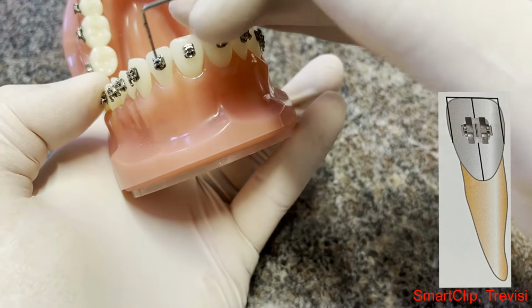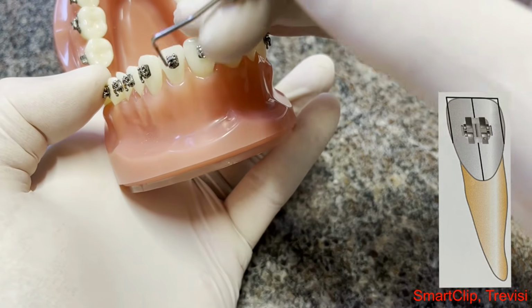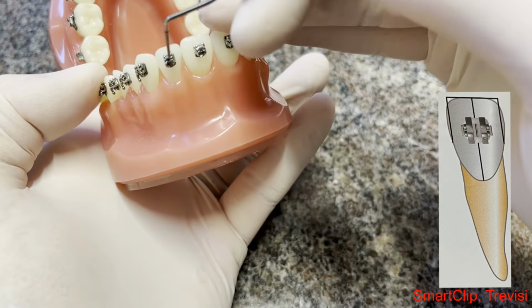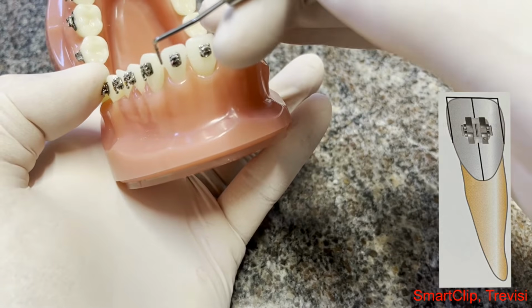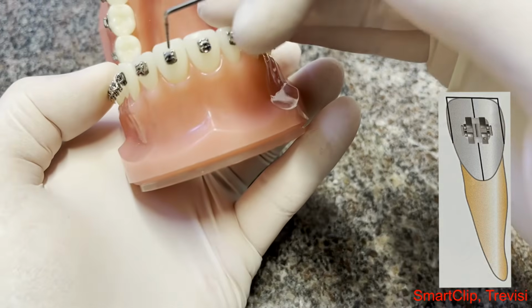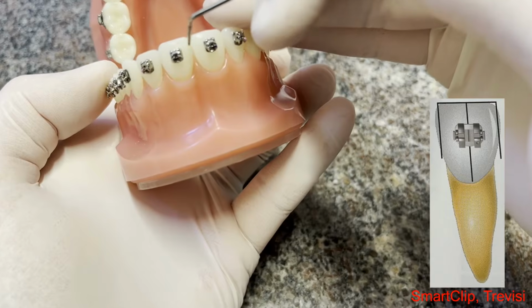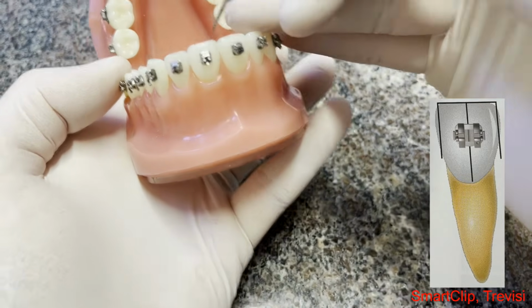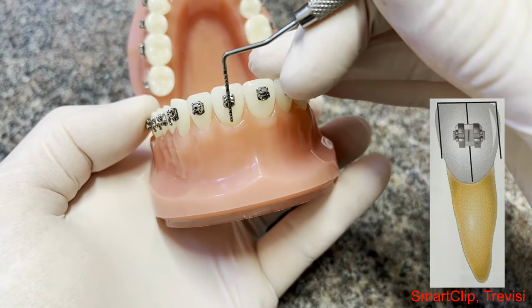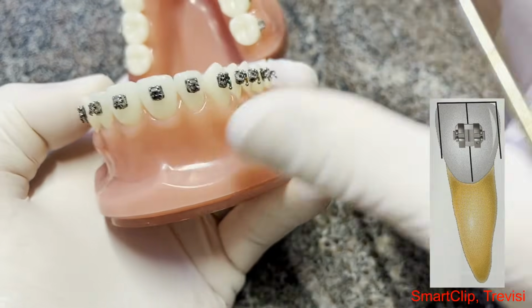So always look at the long axis of the tooth, and the way you visualize that is these two sides right here. So you'll picture a line that kind of bisects those. If it's perfectly rectangular, the line will be parallel to these. Usually it's more kind of triangular, and you just picture a line that goes straight down the middle, like that. And then same thing here. On the centrals, I usually set it roughly parallel to the side of the tooth. Roughly right about there would be the long axis. So that's on the upper.